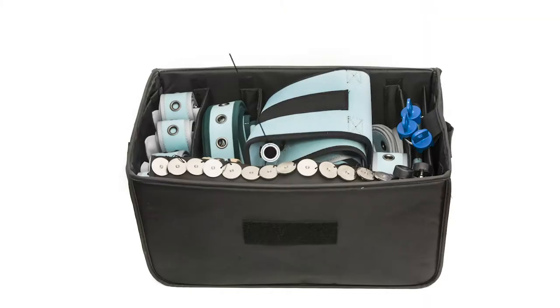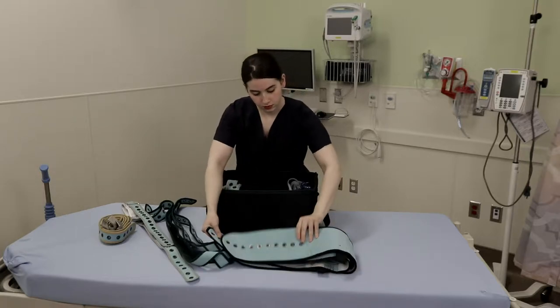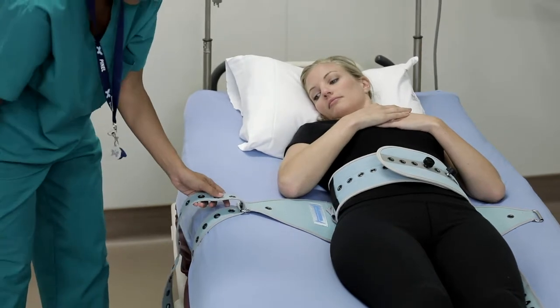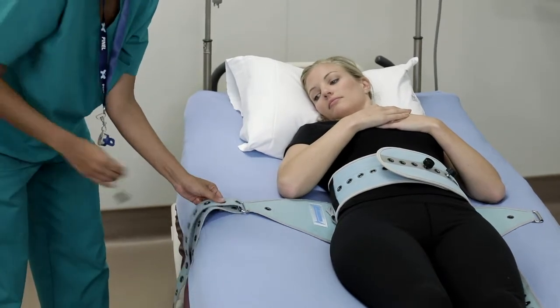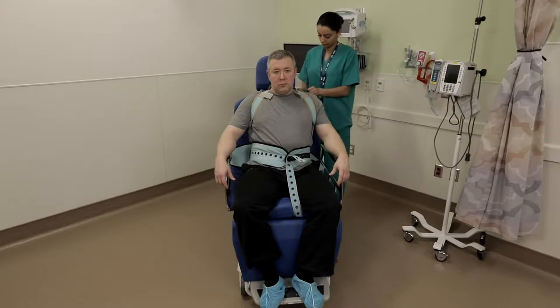The large middle pocket contains the rotation waist belt and two small utility straps, already attached but removable. The waist belt is intended to keep the patient safe yet comfortable in a bed or chair. It can be used as a gate belt that can be transferred between the bed and chair without needing to remove it from the patient.